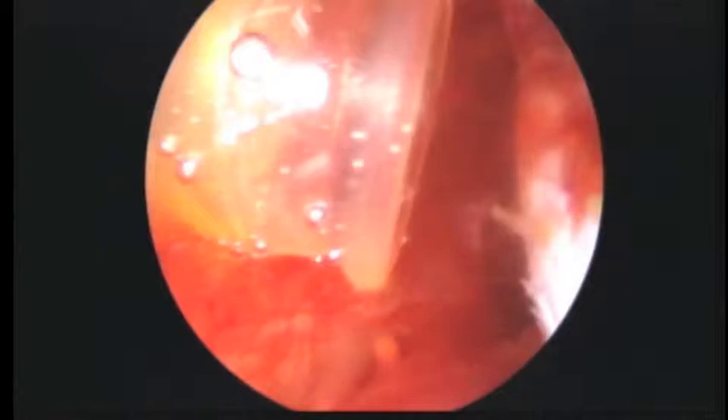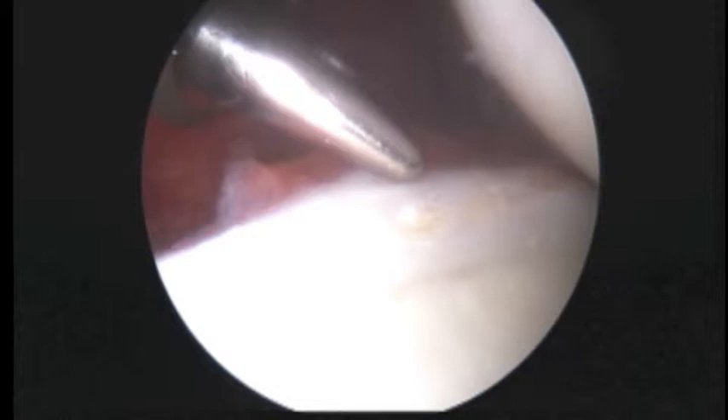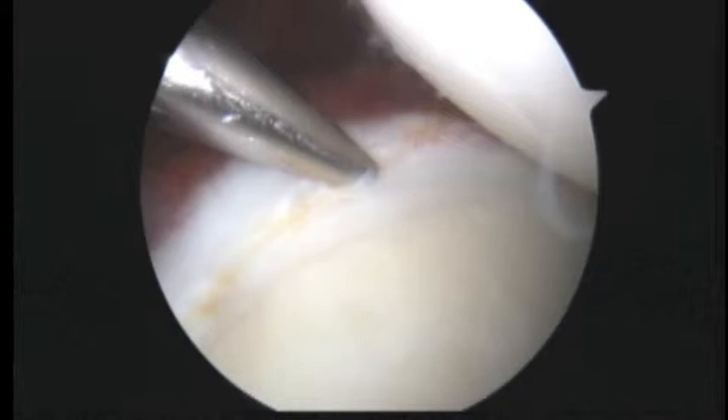As we examine the labrum back here, we can see there's a little split in the labrum. When we have that, I feel much more comfortable placing a suture anchor, because we don't want our sutures to pull apart the labrum. So we're going to try and place an anchor down right about here.